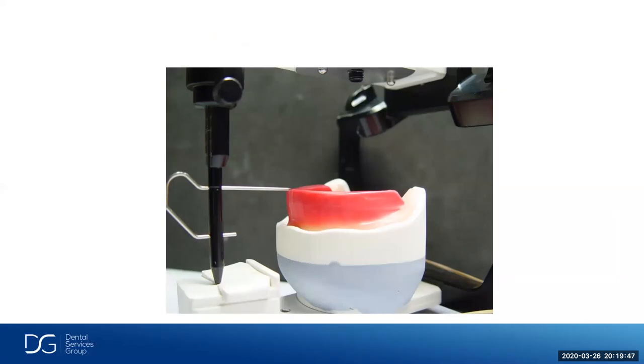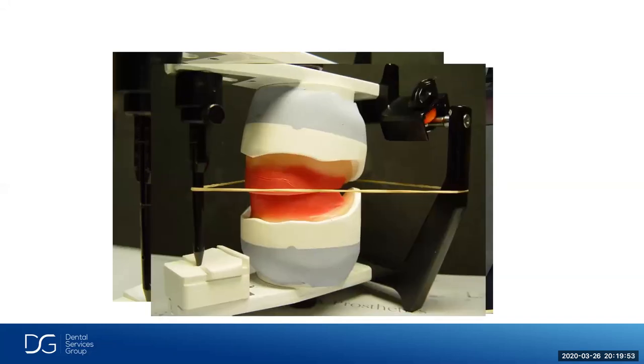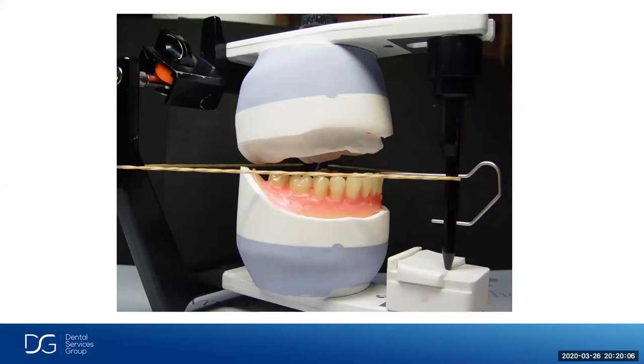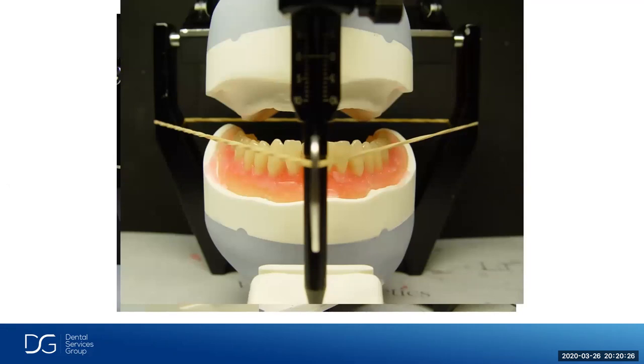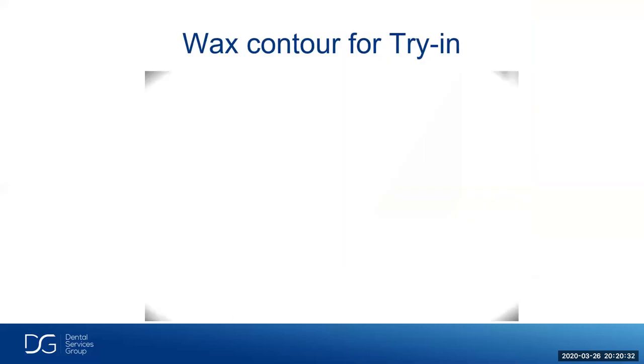So in this particular photo, we're mounting on a fully adjustable articulator, making sure the occlusal plane is correct. I put a rubber band on the incisal pin all the way to the posterior of the articulator, maintaining my Camper's plane and my occlusal plane. I get everything set up correctly. In this particular case, the lower teeth were set first. When I'm setting my denture teeth, I set upper anteriors, then my lower anteriors, and then I set my upper posteriors and my lower posteriors. And then I balance it and check for any interference. So as you see, it's a lot of work. Every tooth has to be set individually. We have to make it look realistic and natural looking. And then we have to contour it for a wax try-in.